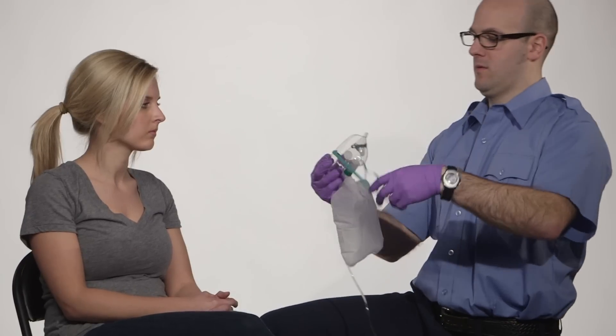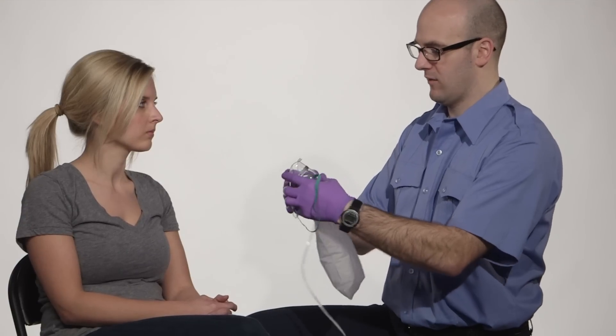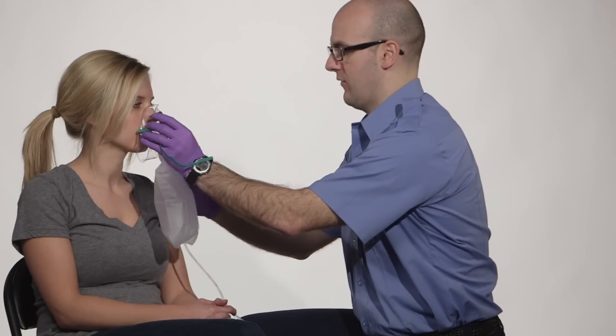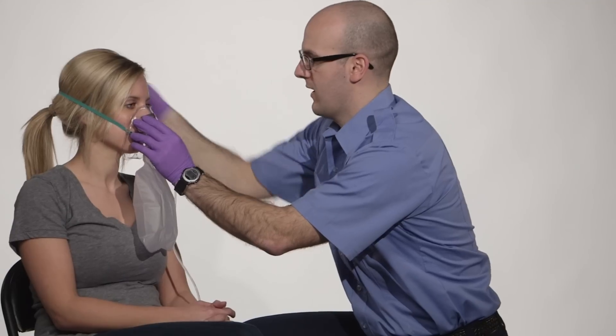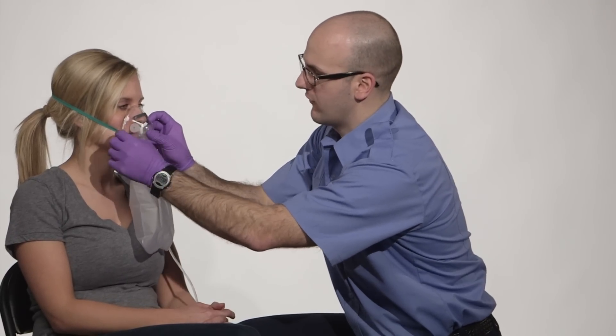And then I will place the mask on my patient. Keeping in mind to do it properly, I'm going to place it onto the face and then come over the back and tighten the straps to ensure that I have a good seal.